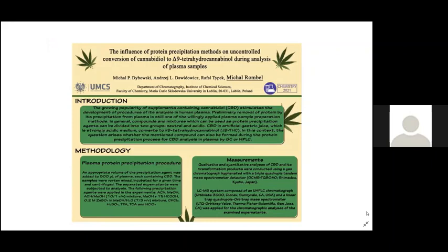Today I'll talk about the influence of protein precipitation methods on uncontrolled conversion of cannabidiol to delta-9-tetrahydrocannabinol during analysis of plasma samples.